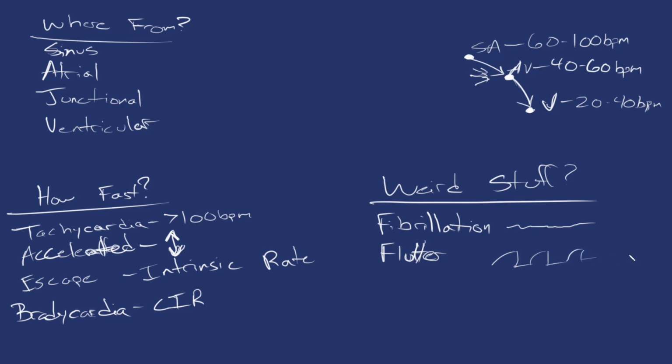Nifty way to see this one. It's actually if you turn the EKG upside down. That's how you can usually see if there's any atrial flutter going on. And again, even though this signal is weird going from the atria, it's still going to the AV node, so it should carry normally past that.